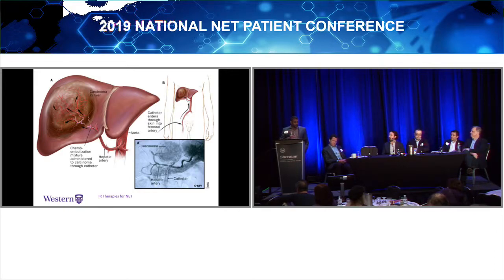And you see in this diagram the catheter snaking through, a lot of times the groin. But we've really migrated to doing these a lot through the wrist now because it's a little bit more of a comfortable procedure for patients. And really snaking right up to these feeders of the tumor and to blast it.